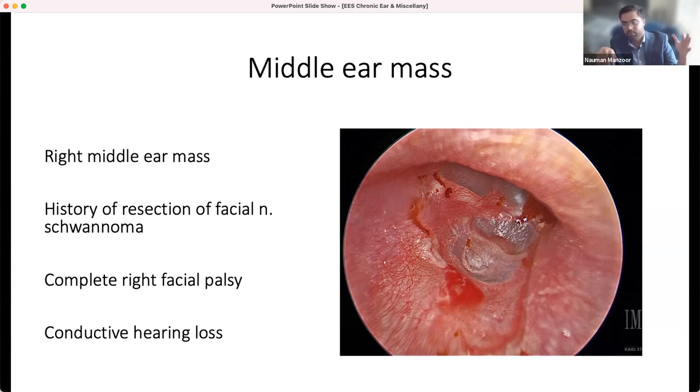I would just get on the manubrium, lift a little bit of the drum from the manubrium and the umbo, so I can slide my graft above the malleus. And then I flip everything back down together. So okay, I think the jury's out there. I know Jake Hunter and other people who do this, they don't like it sometimes, but I think it can be useful sometimes if you are struggling. Yeah, I personally don't use that technique.